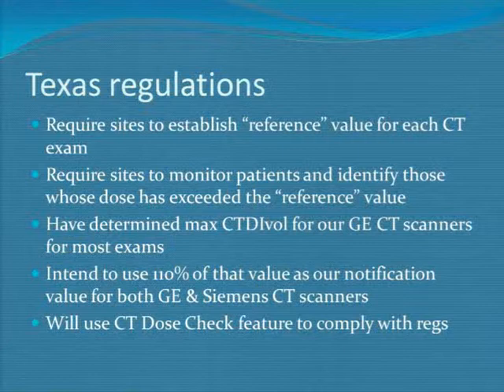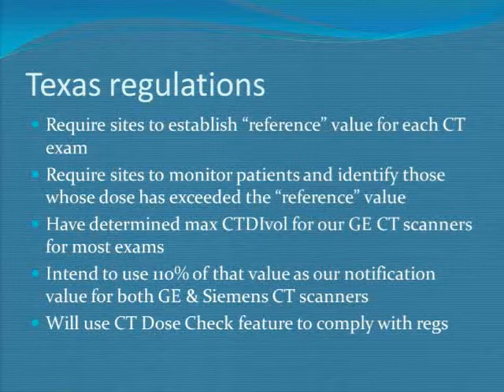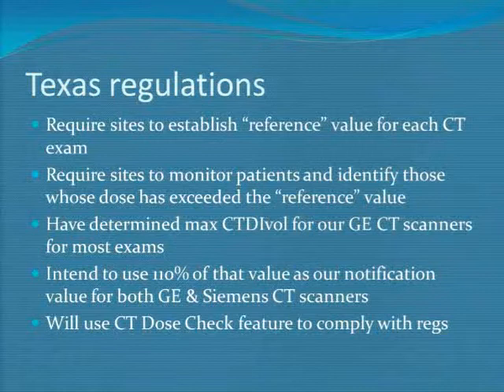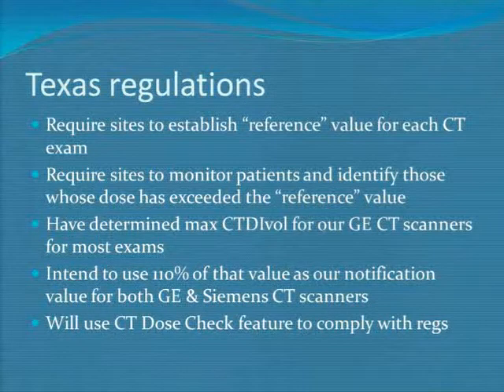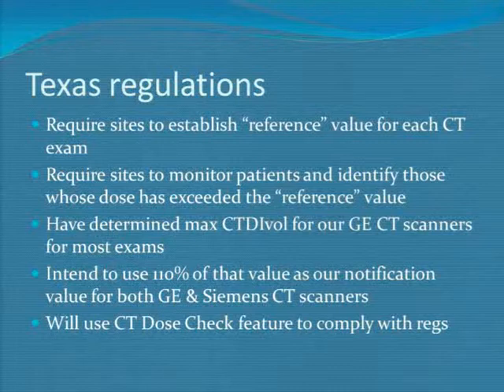So that's kind of how we have interpreted this. And my feeling is that if we hit it on a GE scanner, that's a true screw-up. We really need to do something before we go forward on that. And so we set it up in a way that it should not ever be hit. Maybe that, and it is a safety value. It may not be quite what the regulators had in mind, and we'll see how they feel about that when they show up next month. But that's how we've set it on our GE scanners.